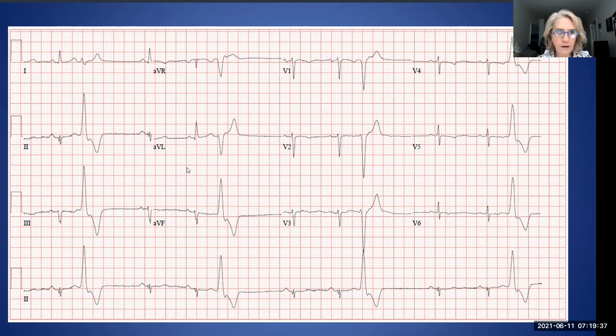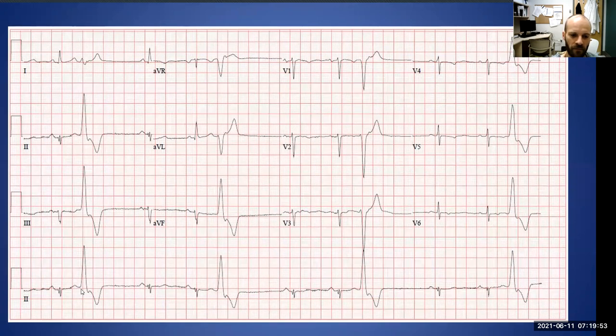For the QRS, I have normal. Mm-hmm. So these ones are certainly normal. What about these big ones? You're right. These ones are certainly narrow. But do you think these other, every third beat, do you think that's a normal or a broad QRS? Yeah, I guess.